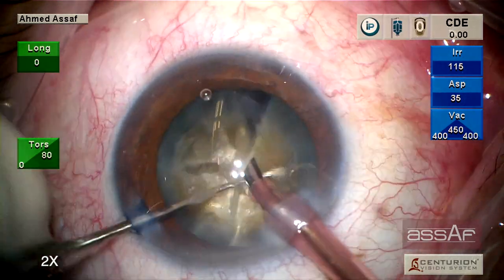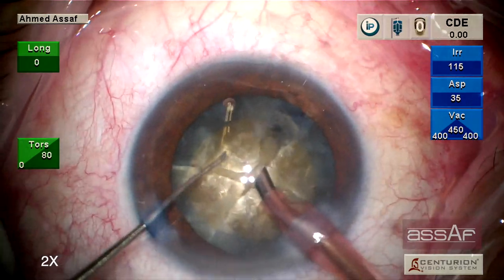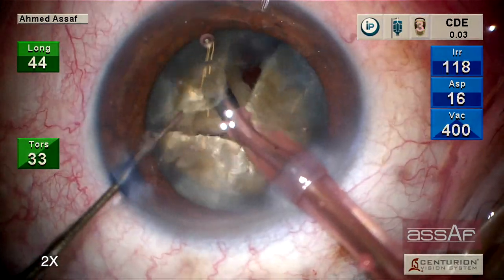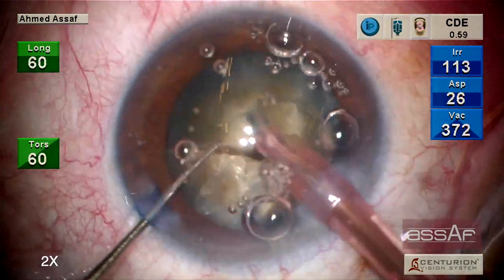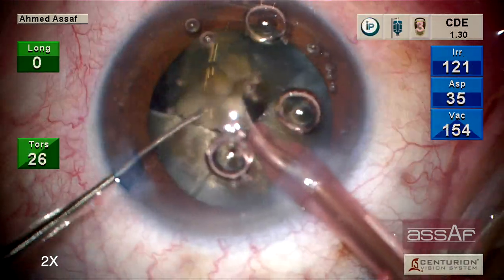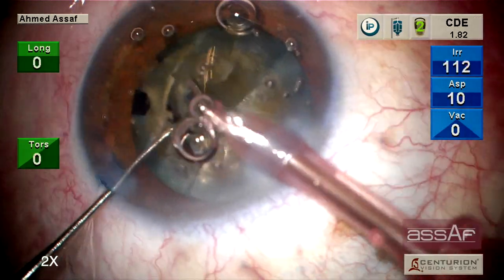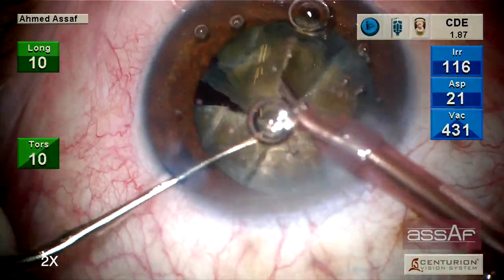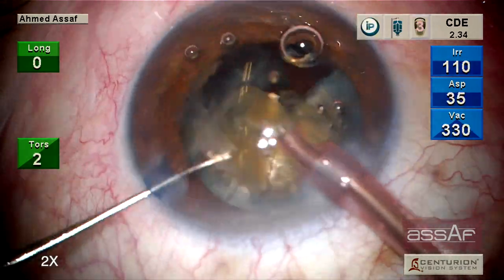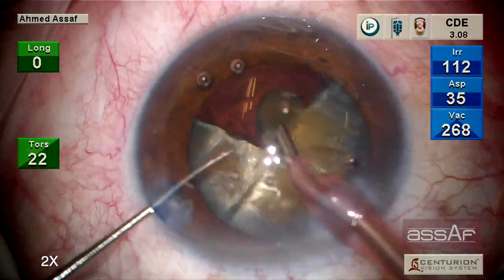I have fast-forwarded this part of the surgery because this case has been converted from a challenging nuclear 4-plus prunescent cataract to just a routine phacoemulsification of a nuclear 3 cataract. The advantage of the MyLoop here is that it is very gentle on the lens zonules, so it can be employed in cases of zonulopathies. We have complete separation of the lens quadrants with the MyLoop.